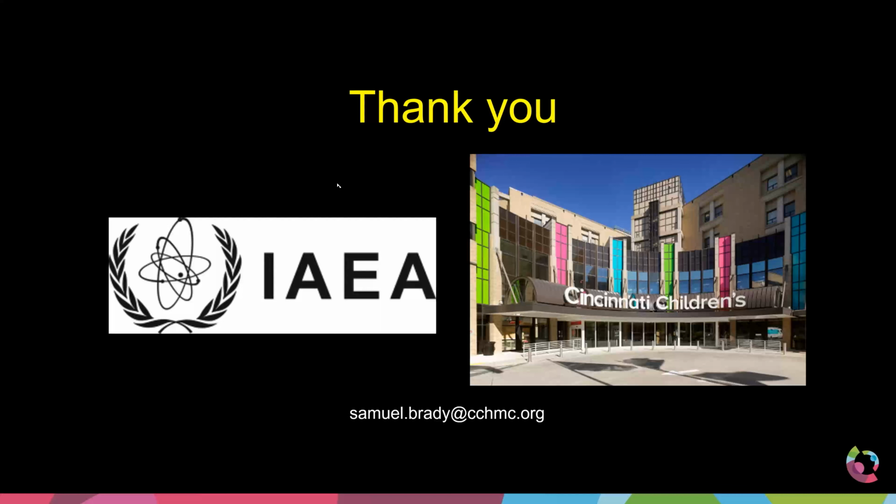It doesn't only start exactly at zero. It could start here, here, or over here. We never know exactly where it will start; it's perfectly random. But we know exactly where it is when we do our localizers, and when we have the laser light on. Those are the only three places we know where the X-ray tube is. I see.